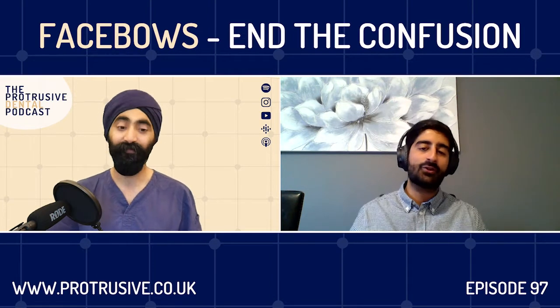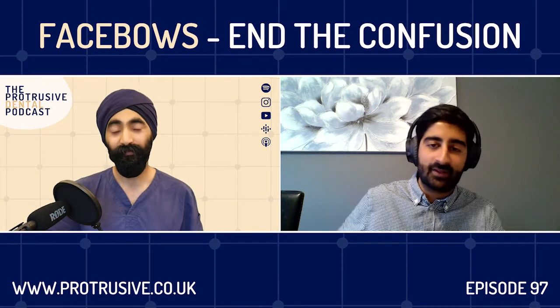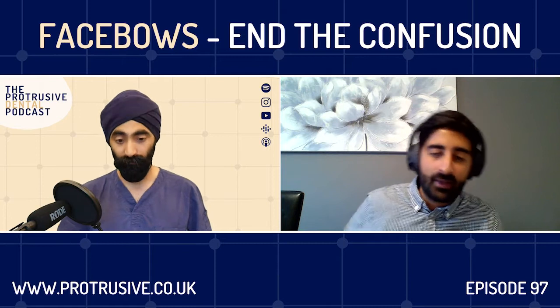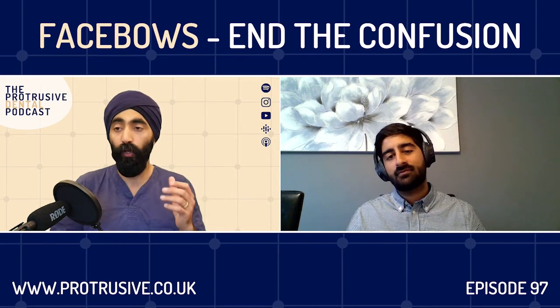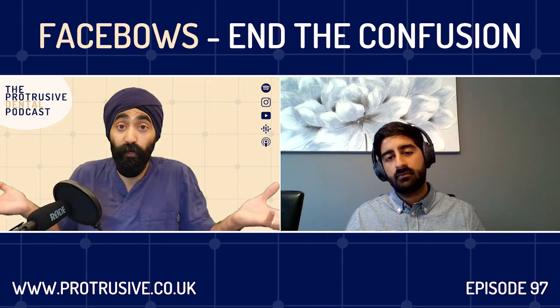So there's no one trick that fixes everything for you. Jazz is right. It's multiple steps to get to that final result. And that Facebow is just one of the small steps along the way that may increase your success rate. And we discussed it in terms of a Michigan splint as well once before, whereby yes, there are reasons to use a Facebow. You could totally do a Michigan splint without a Facebow.